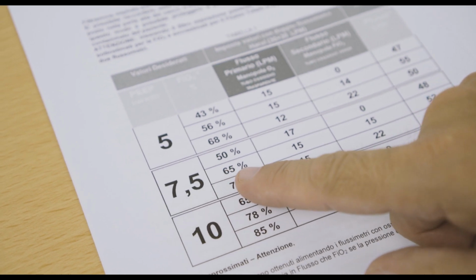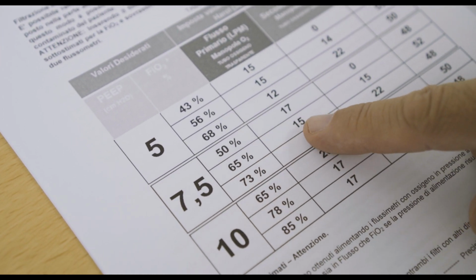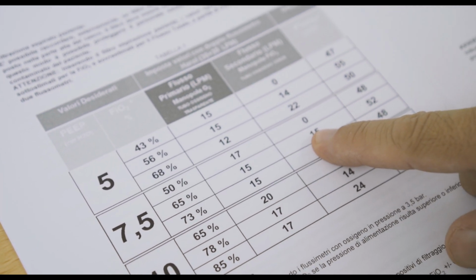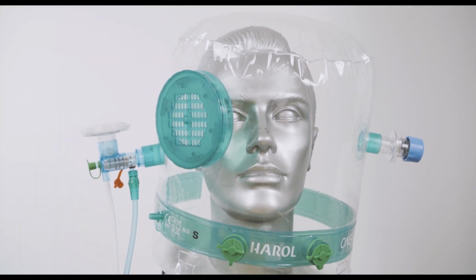If I want a higher FiO2 instead, I will act on the second flow meter, bringing it to 22 liters per minute. In general, we keep in mind that the higher the value of the primary flow, the white line, the greater the flow to the patient. The higher the secondary flow, the green line, the higher the FiO2 to the patient.